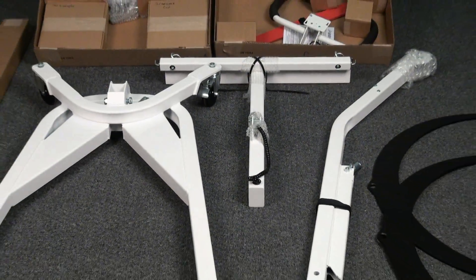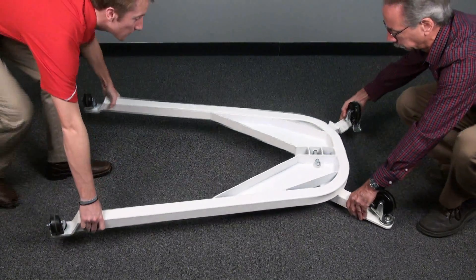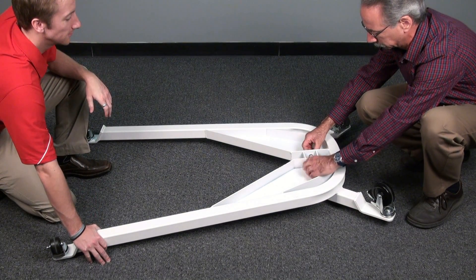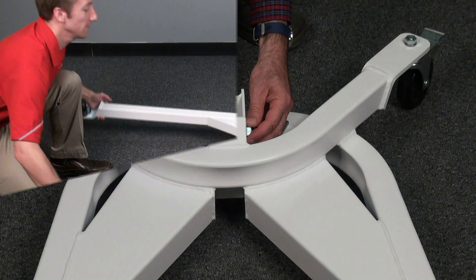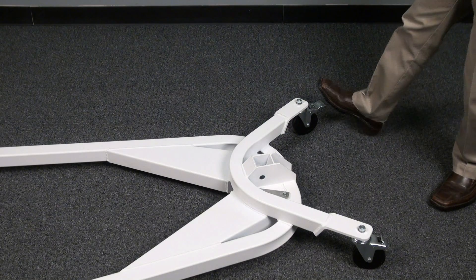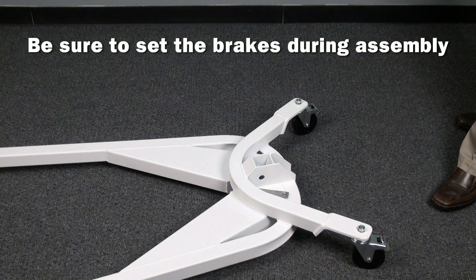The assembly process begins with the base and moves up along the scale. Start with the base, which must be turned upside down in order to expose the bottom bolt that secures the column to the base. Remove the bolt, then turn the base upright and remove the top bolt. Before attaching the column, be sure to set the brakes on the wheel to avoid any undesirable movement of the base.